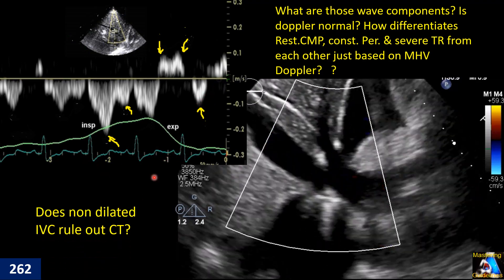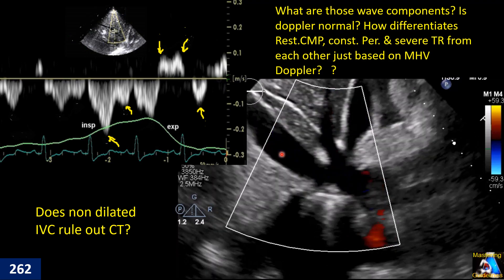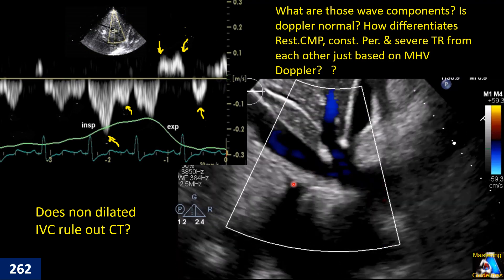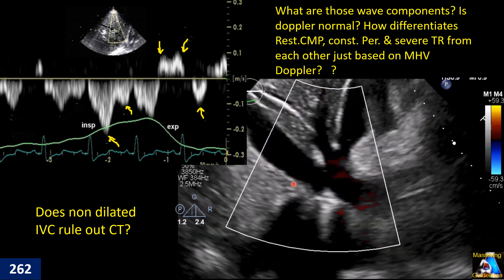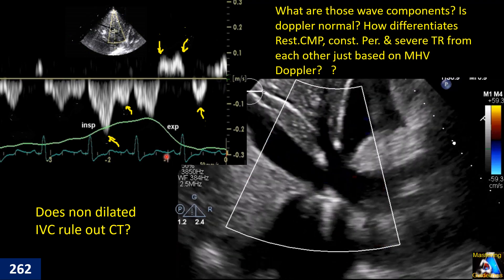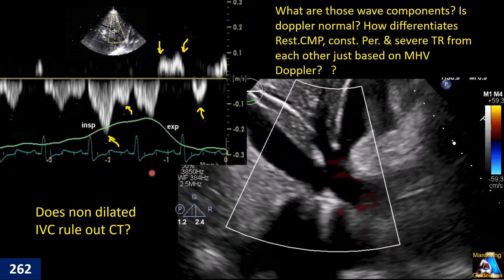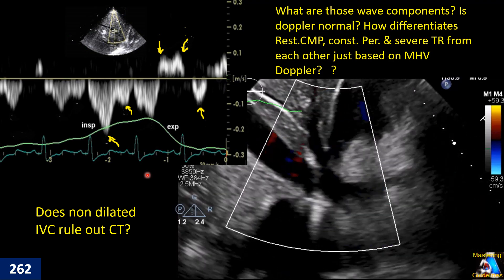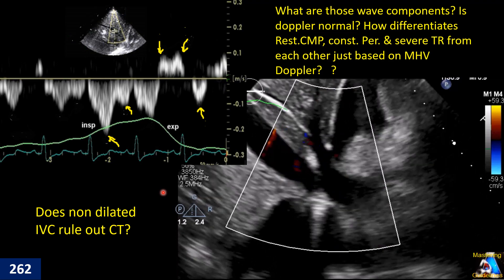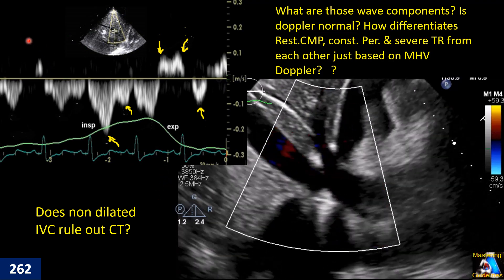The IVC here is dilated and fixed non-collapsible. But if the IVC was not dilated and was collapsible more than 50%, does that rule out cardiac tamponade? If not, in what situations or conditions can we expect the IVC to not be dilated and still be collapsible, even when the patient has cardiac tamponade?